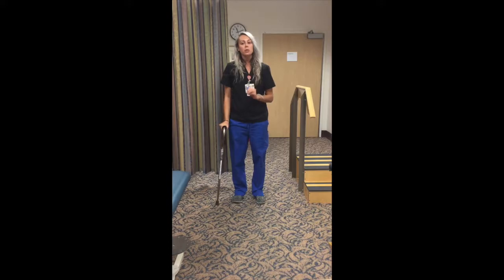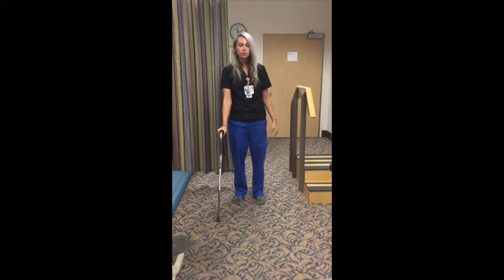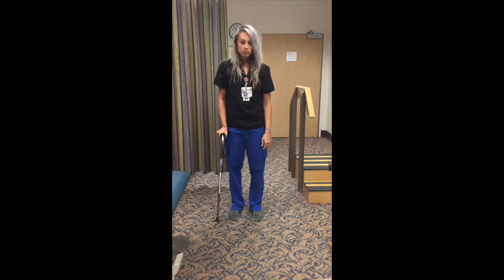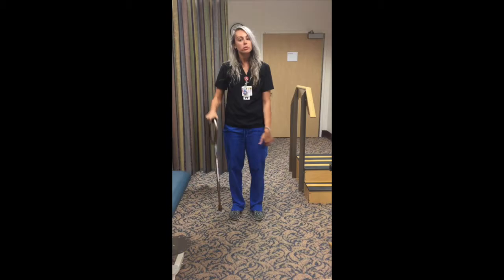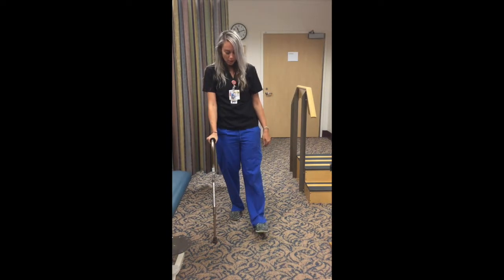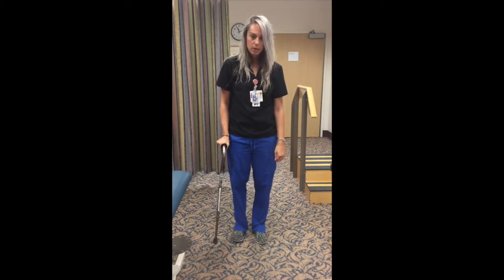Okay, and sequencing with the cane is very similar to the walker in the sense that you're going to be putting your cane forward first, then your operated side, then your good side. So you're weight shifting, but you're not putting weight on the cane. It's just there for balance. So cane forward first, operated side, good side.